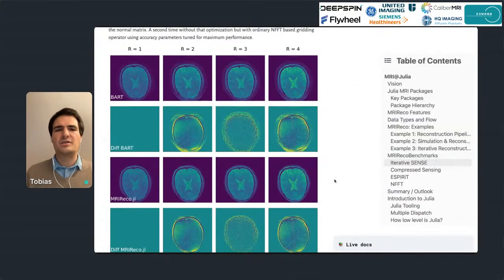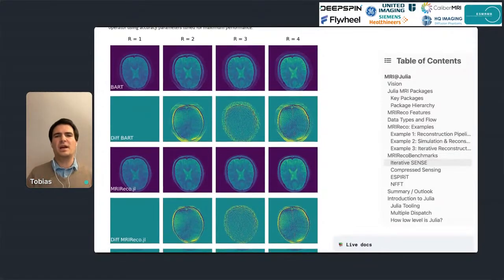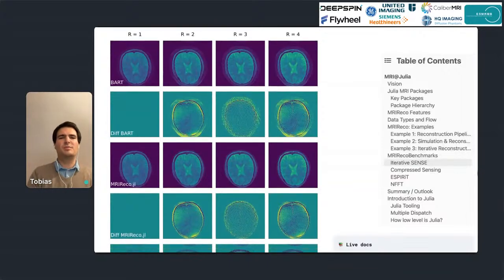And that they look so similar is actually a very good thing, because it means that both our libraries implement the same mathematics, which is not as clear and not as simple as it sounds. So if we write something in our paper about how we implement it, even if we try to match this, we often have implementation details that we are not aware of. So the key thing here is, if we have different libraries and can compare them and make them generate the same images, we absolutely get a better understanding.